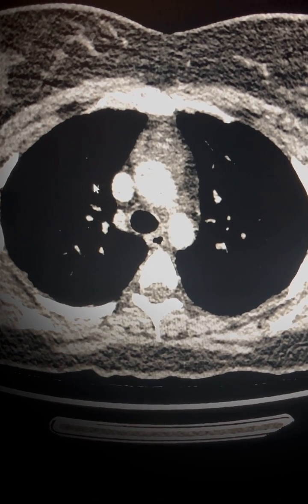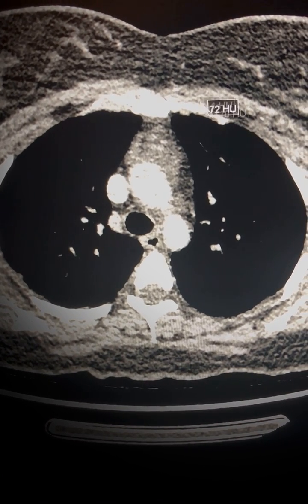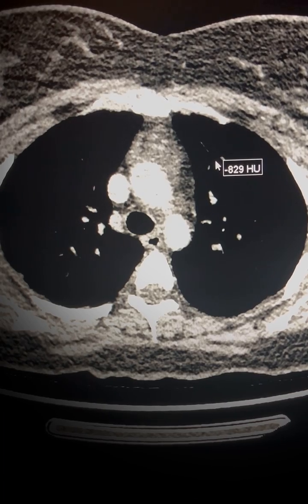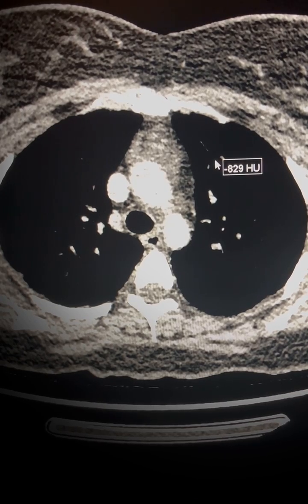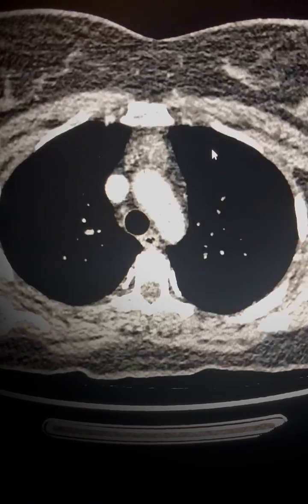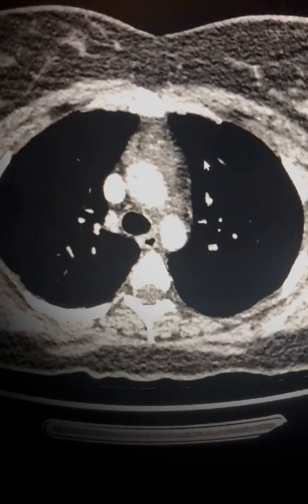On this video we will be reviewing some of the features of thymic hyperplasia and how to differentiate this from other entities that occur in the thymic region.